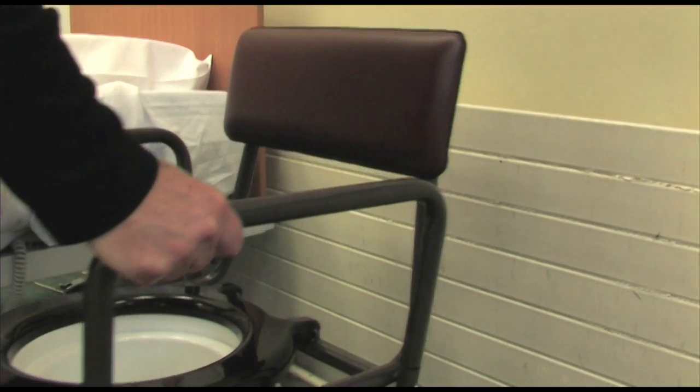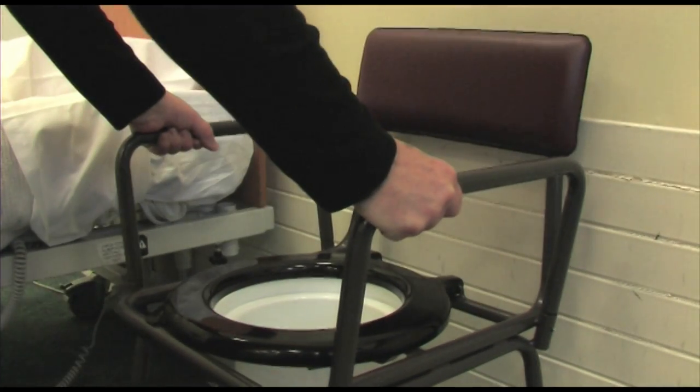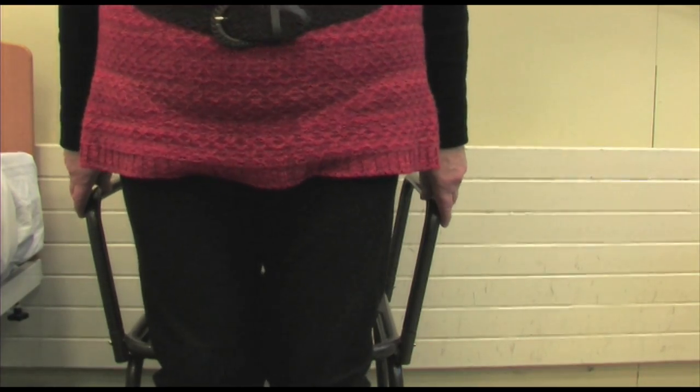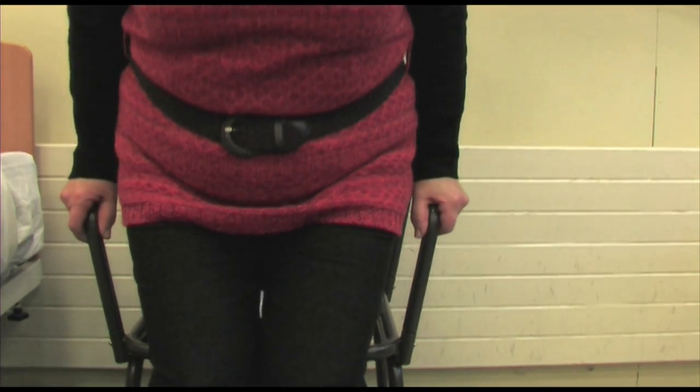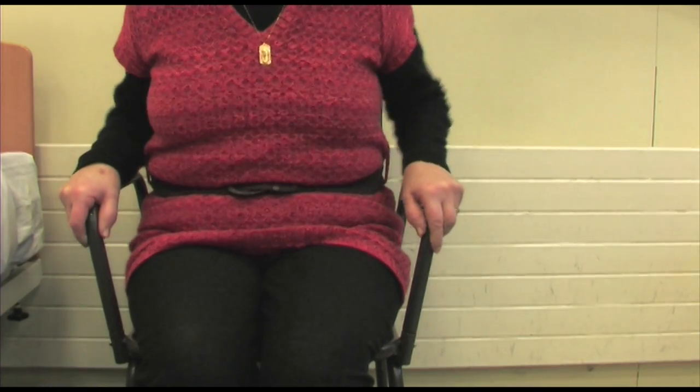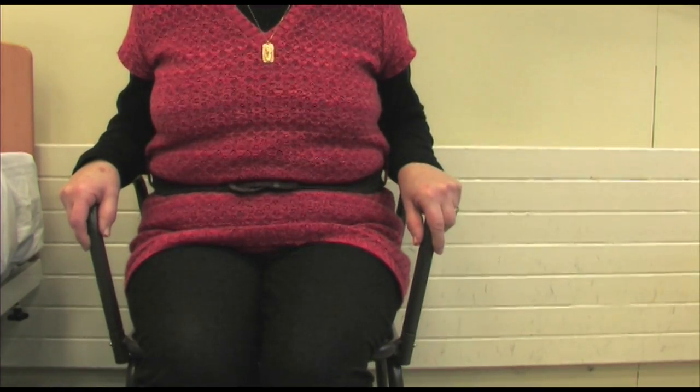Check that the commode is stable, and ideally position it up against a wall. Stand with your back to the center of the seat, reach out, take hold of the handles, and then gently sit down.